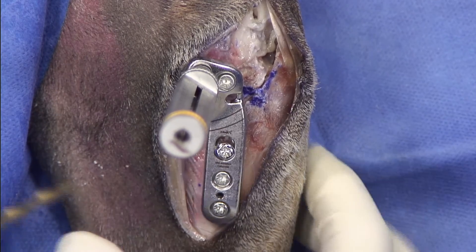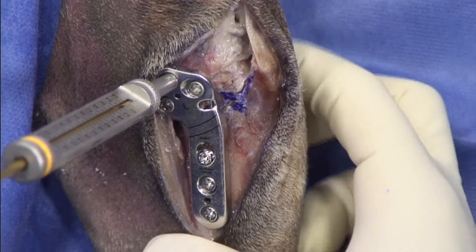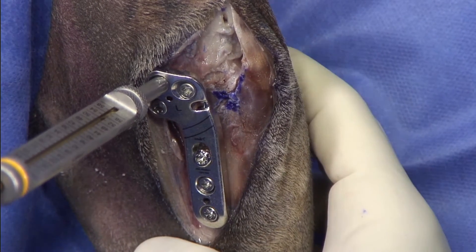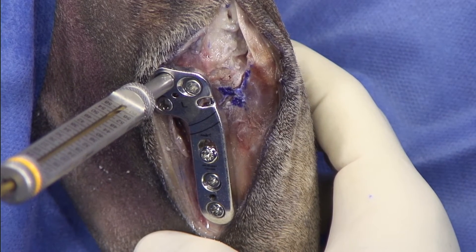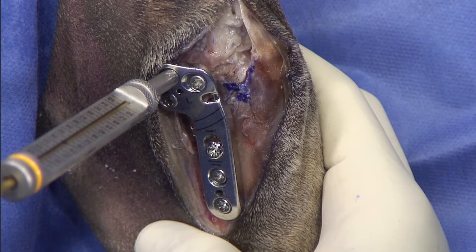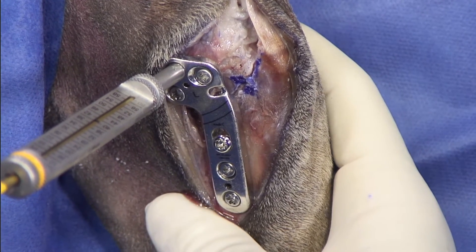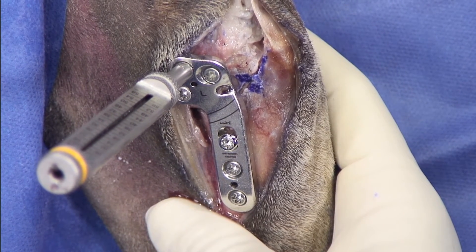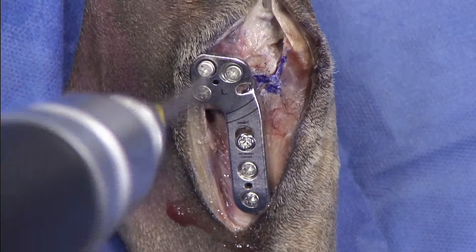When I drill this screw I want to be 100% sure that I'm not in the joint. I like to actually feel where the fibular head is on the other side and feel where my drill bit exits. Ideally the drill bit should exit just distal and cranial to the fibular head. Right now I'm measuring 26. I can feel the drill bit and it's safe, so I can go on. In this case I would go with a 28 — so instead of adding 4 mm in the most proximal one, I would add only 2 mm.